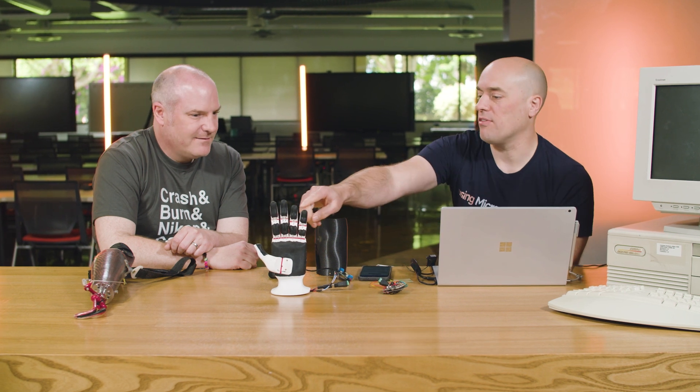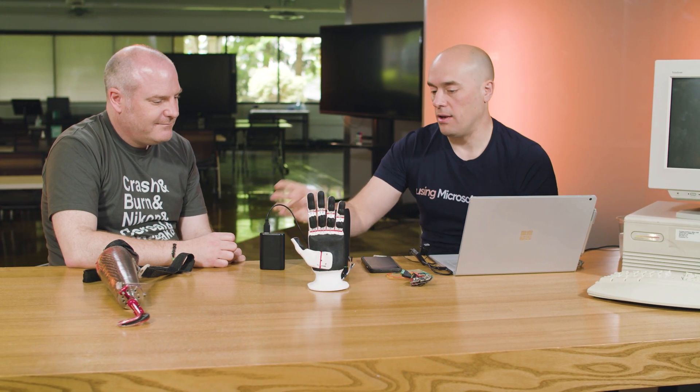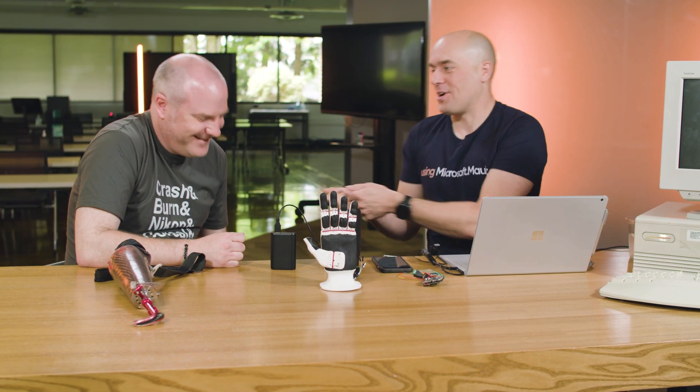If he grows, we just print a new socket, and as he grows we scale it up. If he breaks the fingers — he often breaks the two little fingers because he bends them back and they snap off — they're pennies to print and take less than 30 minutes. It all runs off a five-volt power brick. Even though the motors are 12-volt, I step up the five volts to 12 volts — we're only drawing a few hundred milliamps for a few seconds. The problem is his friends all want to charge their phones, so he unplugs his battery and then his hand doesn't work.